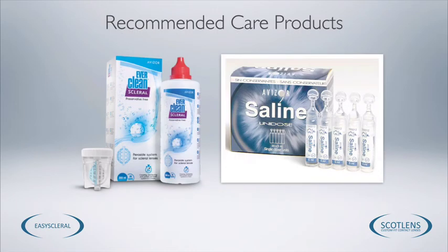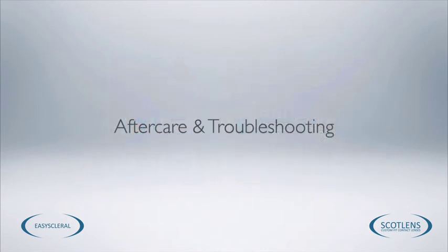The care products that are recommended: we recommend EverClean as the storage and cleaning solution. Using surfactant cleaners like Boston, because the lenses are larger, it tends to damage the surface of the contact lens. This then leads to premature dryness and reduces the lifetime of the lens. So EverClean helps to maintain good quality surface throughout the lifetime of the lens. Insertion should be performed with preservative-free saline.